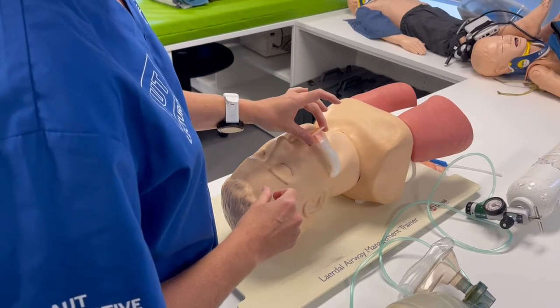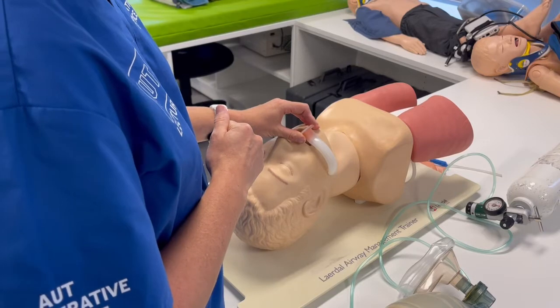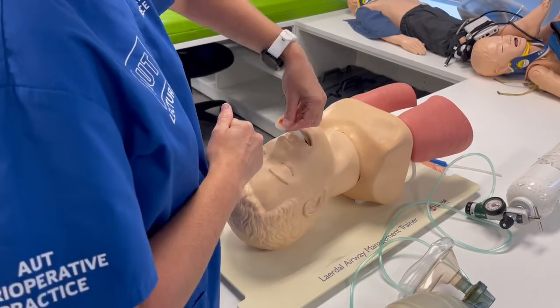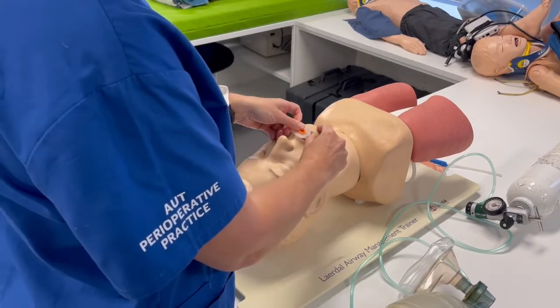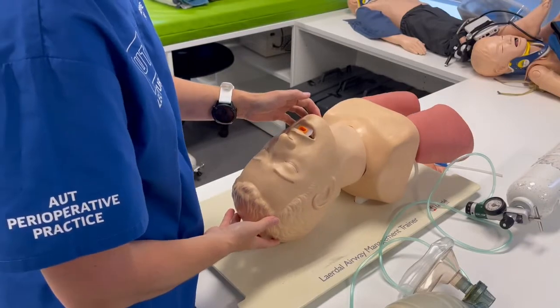To size the airway adjunct, measure from the angle of the mandible to the maxillary incisors. It is inserted with the tip pointing cephalad, then rotate and seat the flange against the teeth and below the lips.